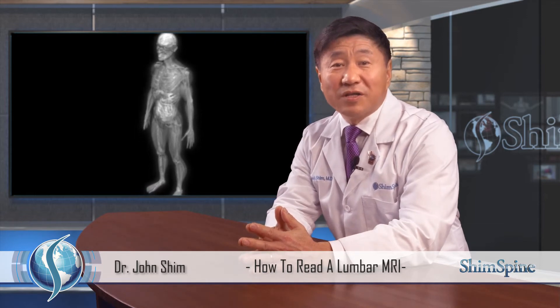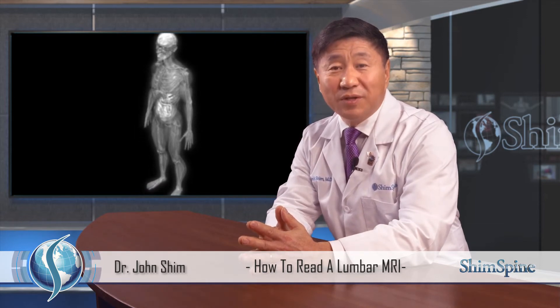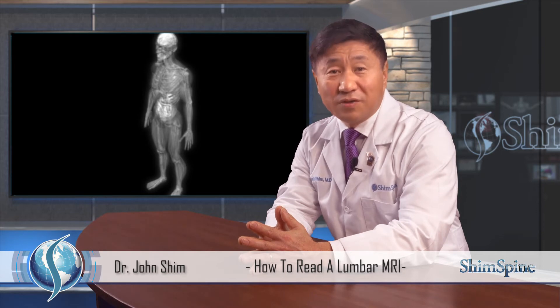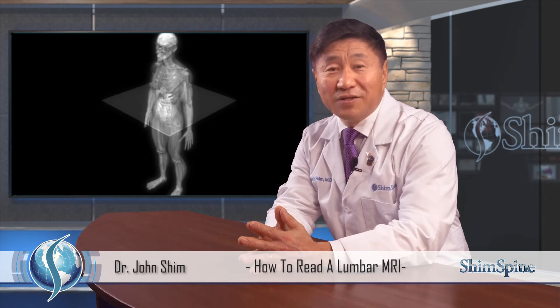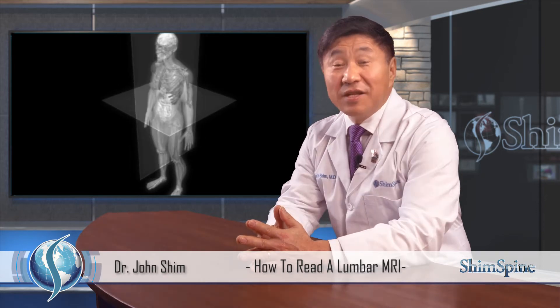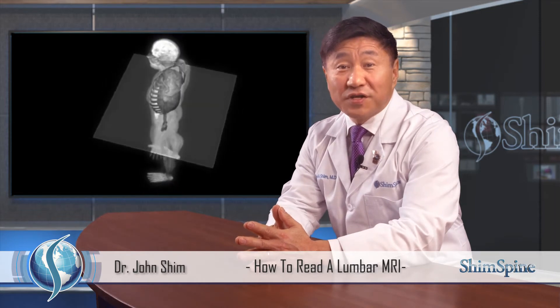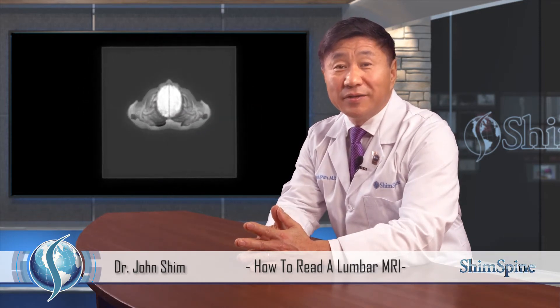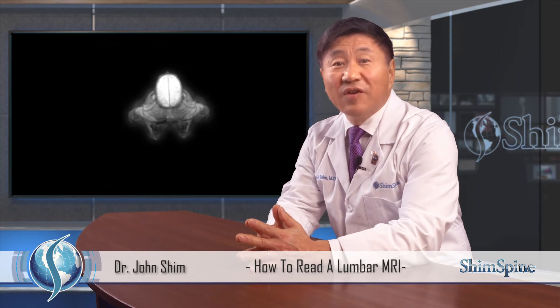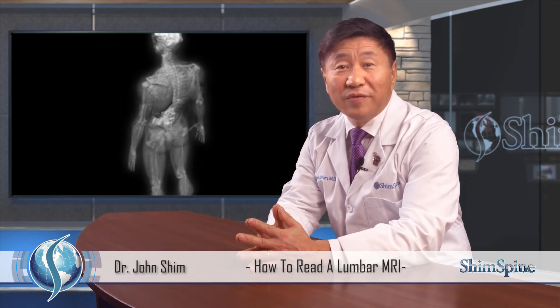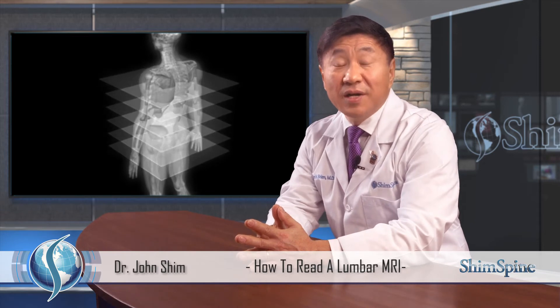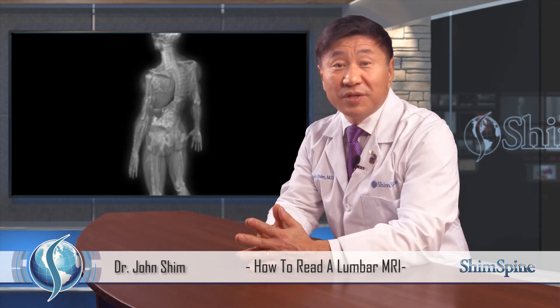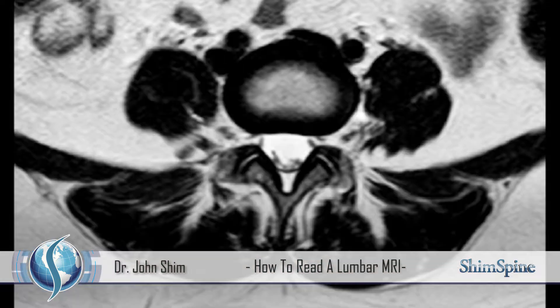Radiologists typically look at spine MRIs in several different planes. The two main planes are the axial plane and the sagittal plane. The axial plane is a cross-sectional view from the top of the body. I like to call it the bologna slice view. If you've ever been to the deli counter, the bologna loaf is placed onto the slicer. The cross-sectional view is similar to the axial view. As you can see on the screen, that is the axial view of the lumbar spine.